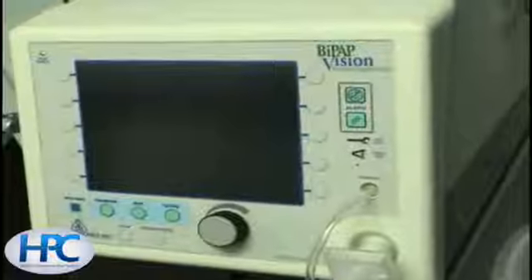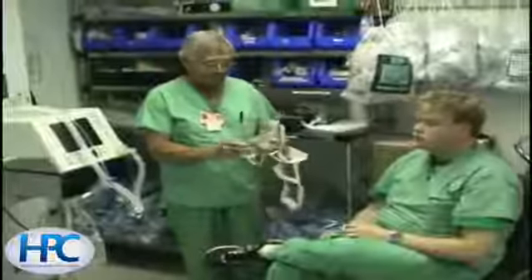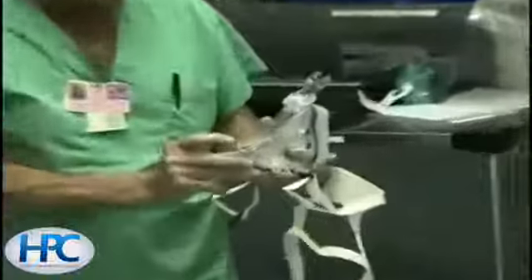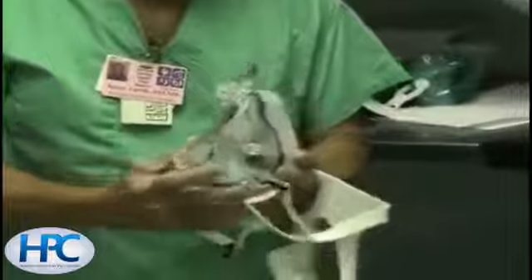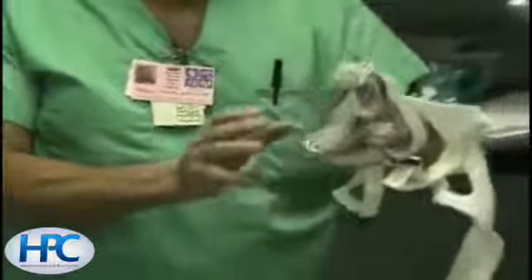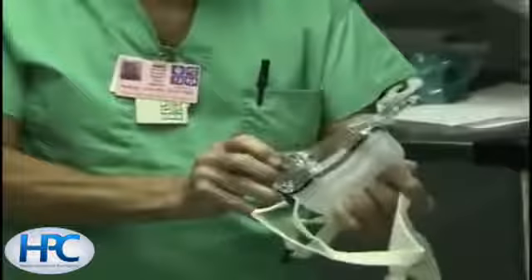This is an example of a BiPAP machine. And here's a BiPAP mask that has a pressure release valve as a safety feature and opens when excess pressure builds up in the mask to allow the patient to breathe environmental air.